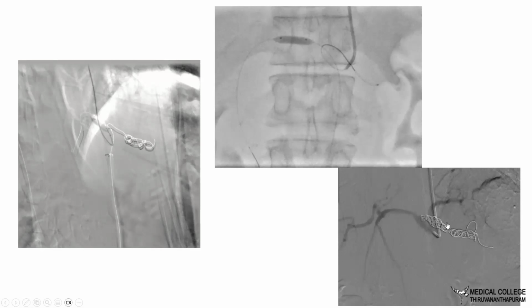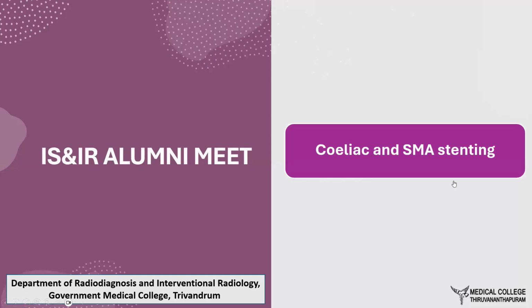The other option of doing a percutaneous thrombin injection may also have been an option, but this was done around 2.5, 3 years ago. At that time, we were not confident in using thrombin at this particular location, that too in a patient with pancreatitis.